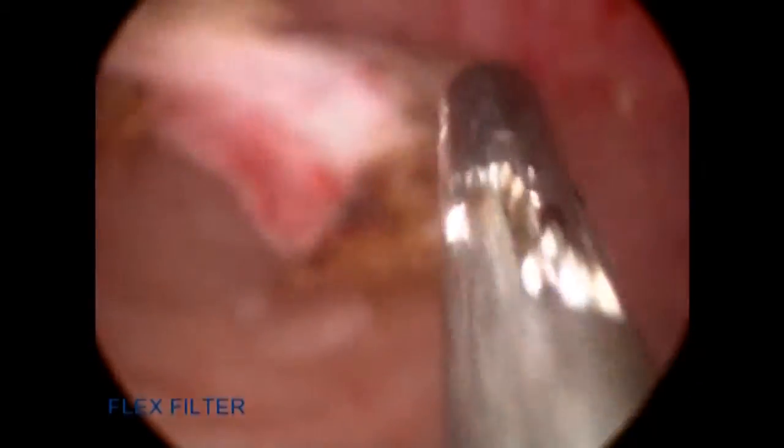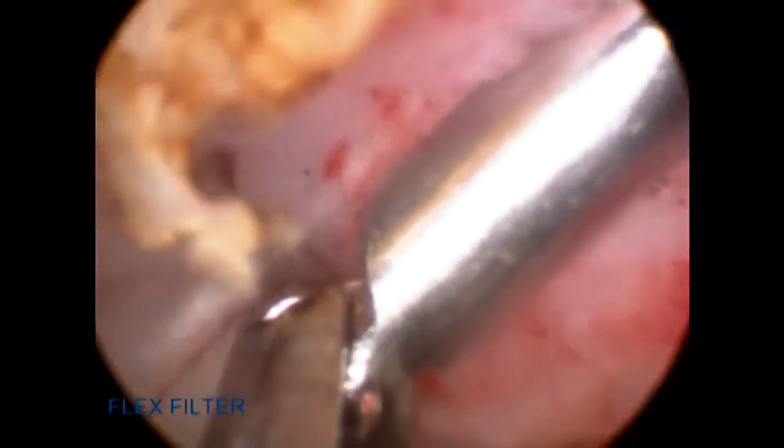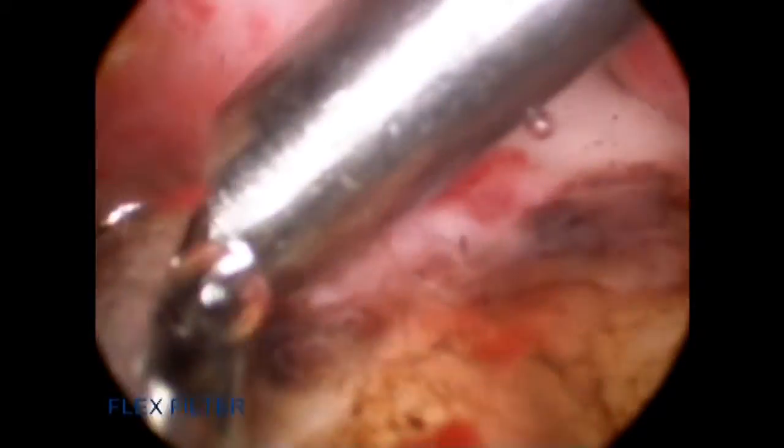I generally remove the enucleated tissue at the end of the case with grasping forceps. In the process of removing the tissue, it may cause some bleeding at the prostatic bed. I will then go back in with either the end-firing or side-firing fiber to coagulate any necessary bleeders, which is very easily and efficiently done using this laser.